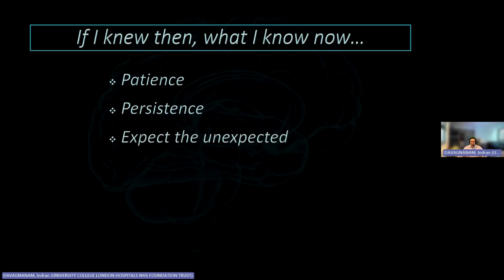I showed you a few cases where, if we left it at where we thought things were going to end up, for example, with the big meningeal diverticulum, we wouldn't have found the leak until we turned them over, or did some other maneuver. You have to mitigate expectation.